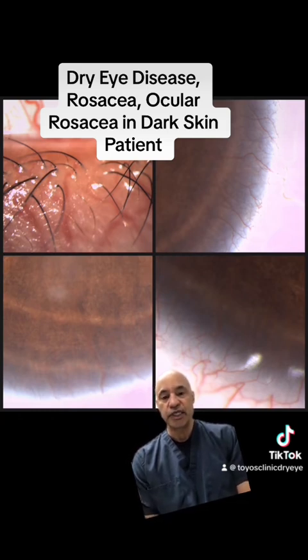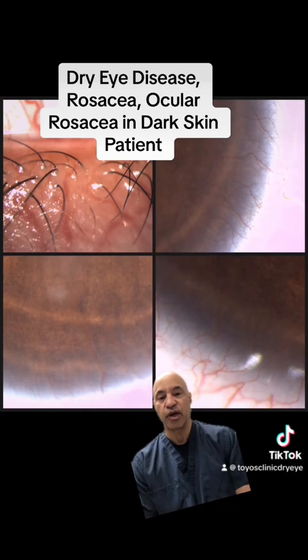Now, the other misconception is that you can't do intense pulse light on these patients. The technology has improved so much, and with the protocols and parameters I have set up for intense pulse light for dry eye, we do have the ability to actually treat these patients with intense pulse light. But you have to be an experienced IPL treater to be able to actually do this kind of treatment. You have to get the parameters just right. This is why we have courses in intense pulse light and workshops, so I can train doctors on the parameters, protocols, and actually the theory behind treating this patient.